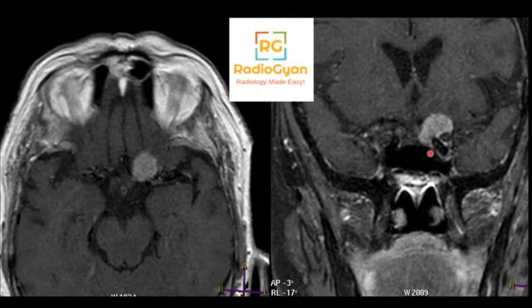So the reason why it's called that is because contrast comes in early and stays for a longer time. So some frustrated radiologist has equated that to a mother-in-law who would come early and stay at his home for a long period of time. Yeah, so comes early and leaves late.